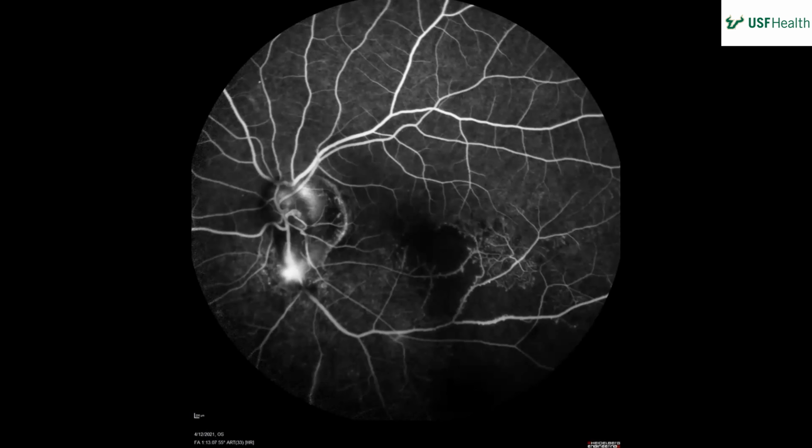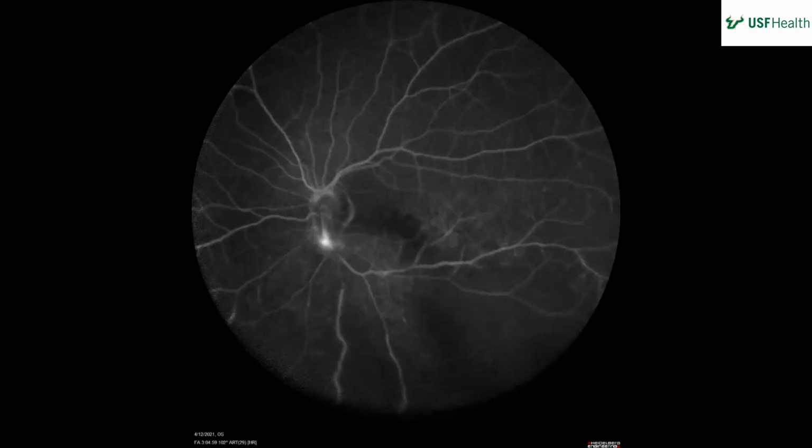So there's quite a few of these pictures. There's that 1 minute, then later on at 3 minutes. Okay. So now I guess is a later phase. Again, there's that little bit of leakage inferior to the nerve. It could be, honestly, I remember on the fundus photo there was that little hazy component coming off of the nerve, and with the OCT, it might be a vessel actually going into the vitreous, possibly from that area that's filling up with fluorescein.